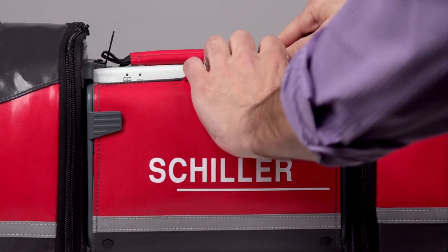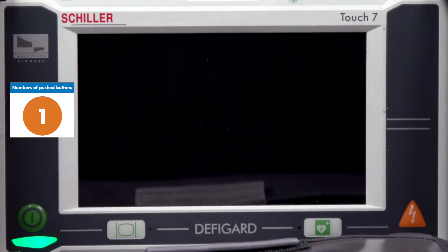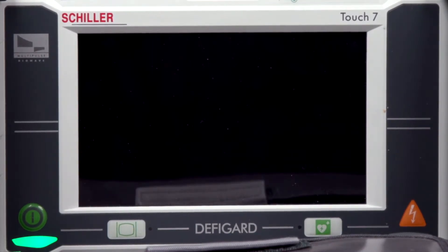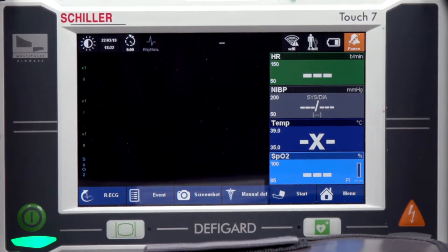The first thing I need to do is pop the front part of the bag down, turn the device on, take out my 4-lead cable, and put my 4-lead cable up to the simulator.